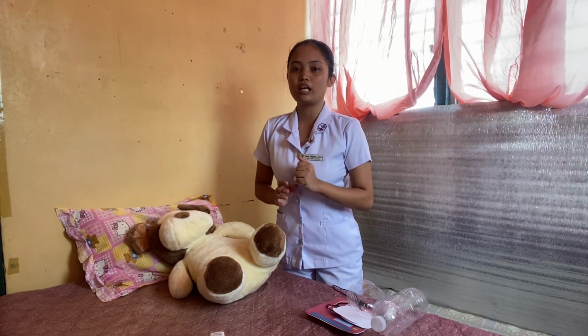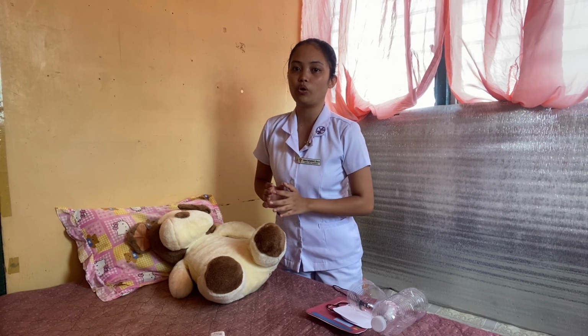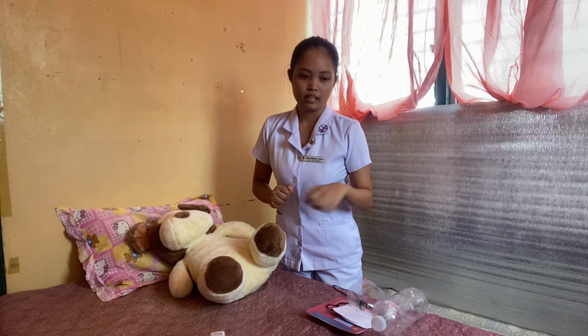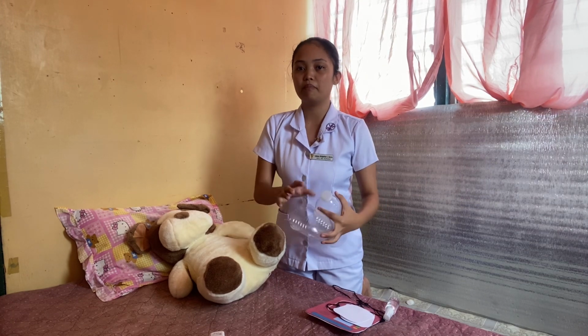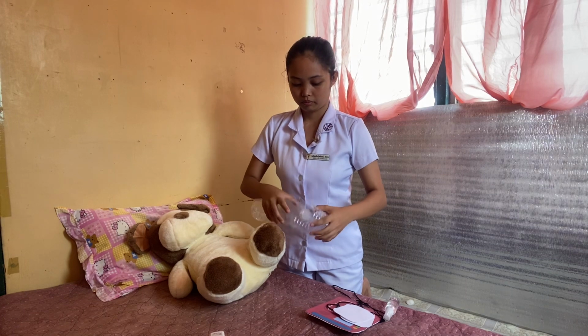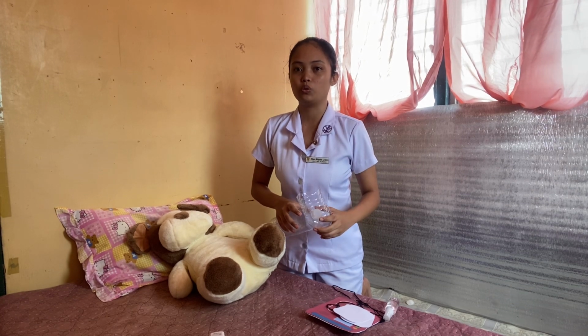So there are 2 types of PPV. It could be invasive through the use of a ventilator or the non-invasive one through the use of a pediatric bag valve mask. Now this time, I'm going to use a bag valve mask to cover the baby's mouth and nose with it.